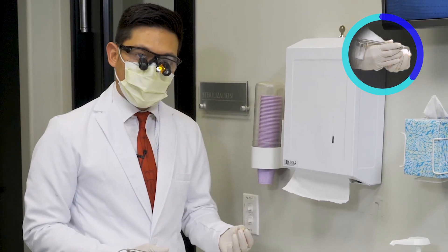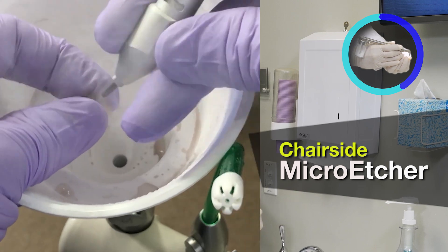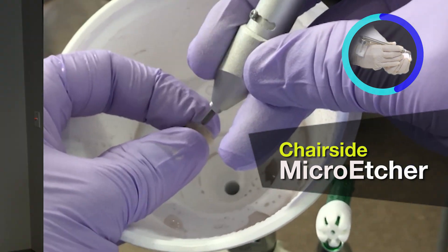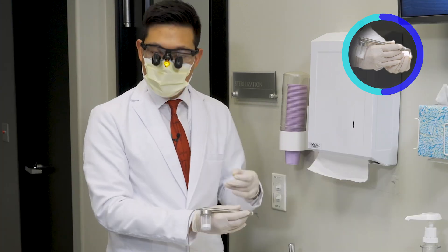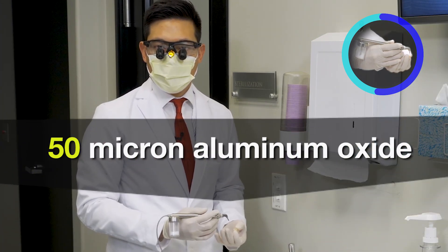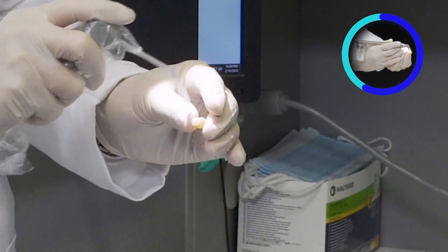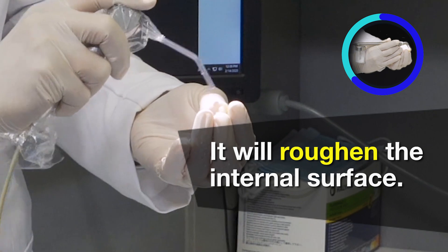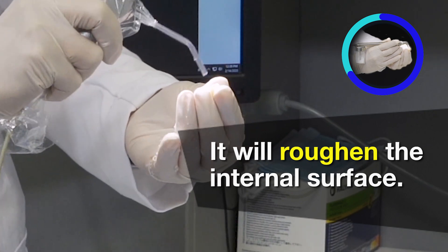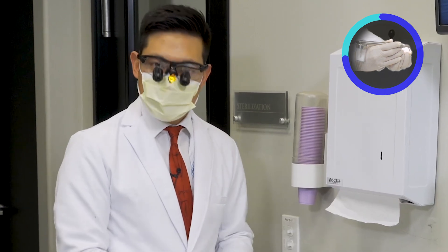One of the best ways to decontaminate the internal surface of the restoration is to use a sandblaster, or in this case we're using a chairside micro etcher. Within this vial we have 50 micron aluminum oxide, and this will help not only remove those salivary phosphates so that we have a clean surface to bond to, but it will also roughen the internal surface so that we have extra surface area for the zirconia primer and then subsequent resin cement to bond to.